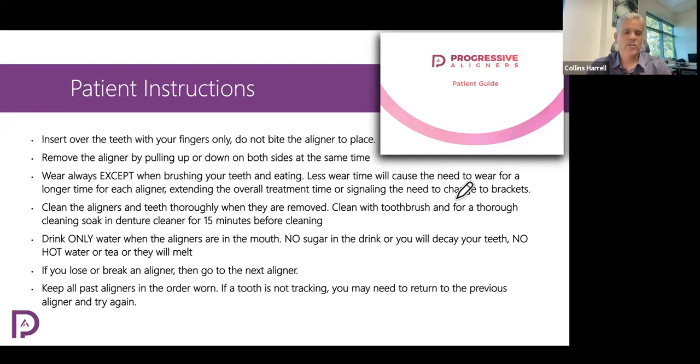And when you take the aligners out, you need to put your fingers into the back of your mouth and pull from the back. That's the easiest way to get them out. So seating them is front to back, removing them is back to front.